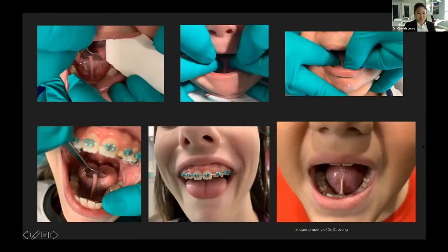These are some of my cases I saw in the clinic. I've seen a lot of them, but you can see here that this tie is going to be more of a posterior tie, but you can see it's really, really thick. This here is actually the frenum. It is not the tongue. So it's really, really thick. Kiddo wasn't able to fully lift his tongue, even 3/4 of the way, less than that, and was having speech issues. And then this little baby, anterior posterior tie, super tight, having a lot of breastfeeding issues.